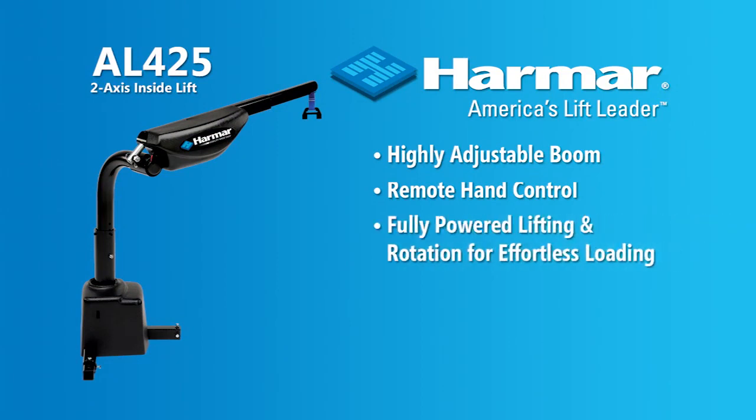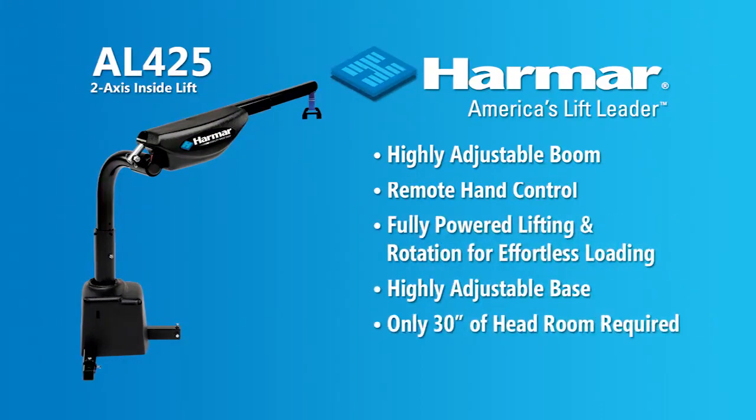Harmar Inside Lifts are the ideal way to load a chair or scooter totally inside. They don't take up a lot of room and they get the job done quickly.